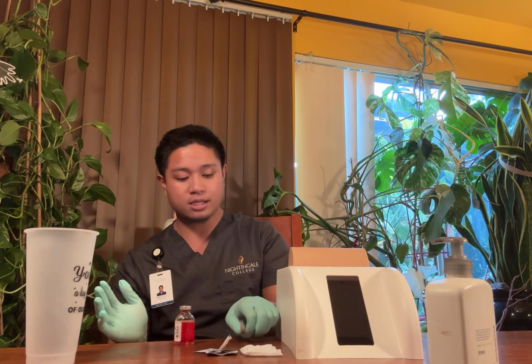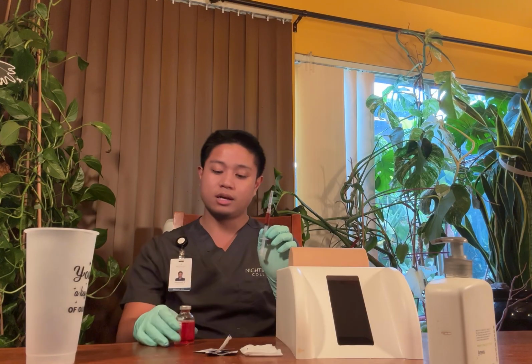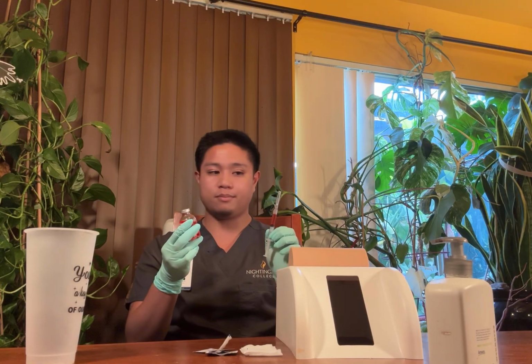So I'll continue with my third safety check, and I will verify that I have the correct dose in the syringe. While I'm looking at the syringe, I'll compare it to the medication vial, and then I'll compare it to the MAR and to the patient's wristband or the patient's name to make sure that they're the same before we administer.